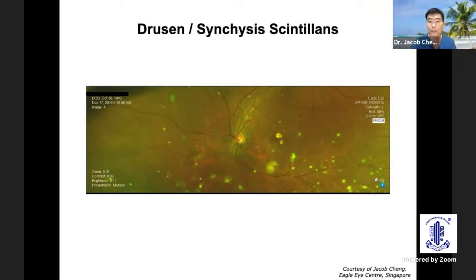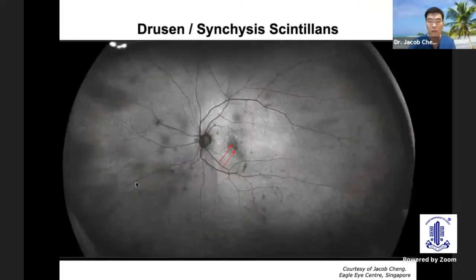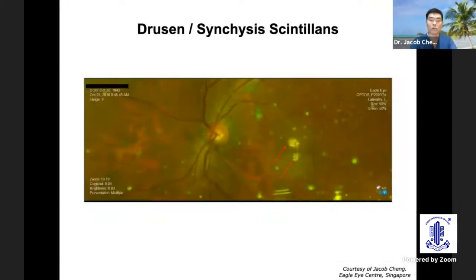the retina or over the macula. It looks also reflective in nature. Again, you can see at the red arrows, these are actually reflective drusen. Here on the close-up view, without losing details, you can see that it is also green, yellowish, reflective in nature, like the synchysis scintillans of cholesterol crystals.